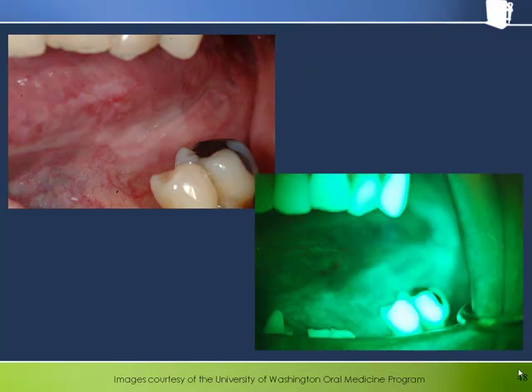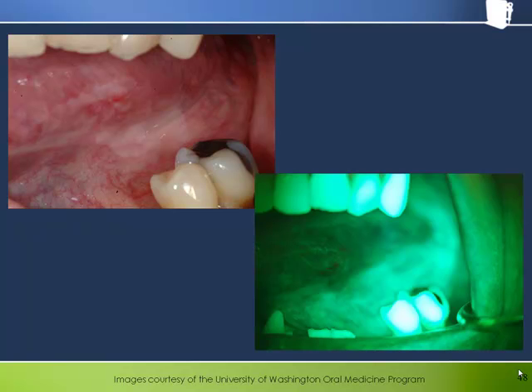The lateral border of the tongue in this patient shows evidence of leukoplakia and perhaps erythroplakia as well. The large area of loss of fluorescence on the lateral border helps confirm that this is a lesion requiring biopsy. Note that the keratotic patch closest to the molars does not seem to exhibit a loss of fluorescence.